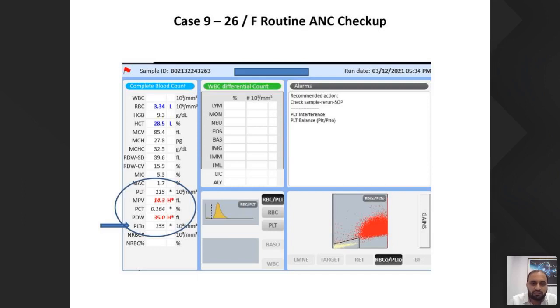the published articles are in favor of these alternative methods of platelet counting, because we know the drawbacks of the platelet impedance count in terms of overlap between microcytes or giant platelets, giving a falsely low platelet count. Especially, as I have mentioned, I'm sitting in an area where we have giant platelets, very huge platelets, almost the size of RBCs, more than the RBC size. And these are all counted as RBCs in an impedance counter. So this is something which is under study.